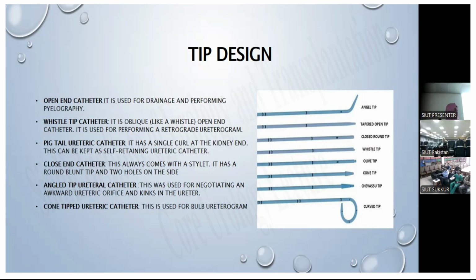So it doesn't mean out of the box that you use something in local anesthesia, but you do within the parameters of certain rules and guides, but you can use your instrument to the best possible knowledge and to the best use of the advancement of technology that is being available to you. So here, different caliber of ureteric catheters are available.